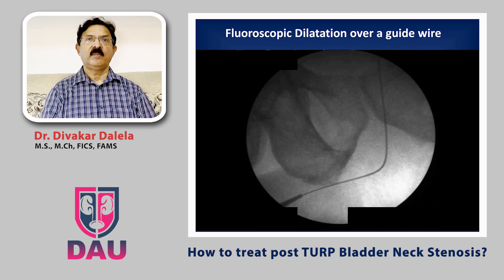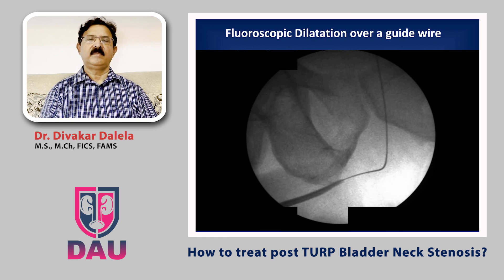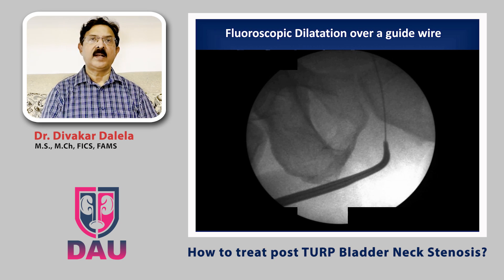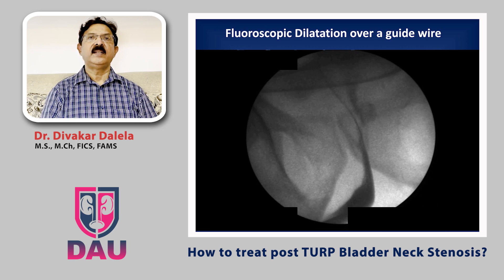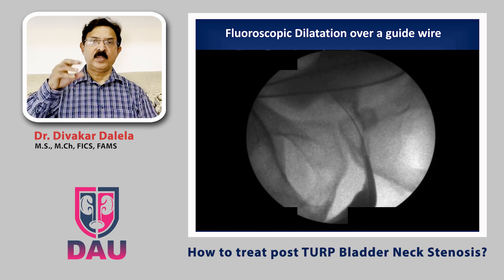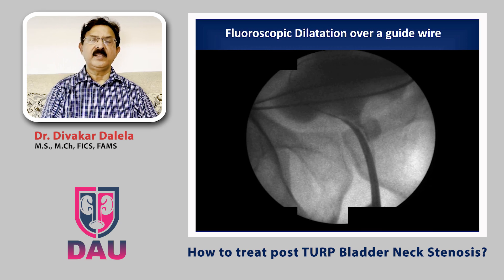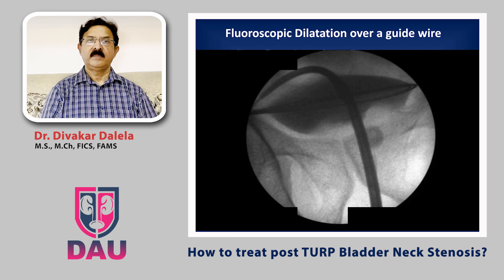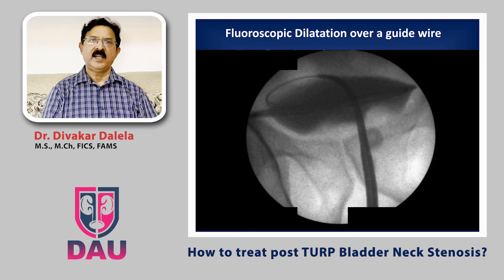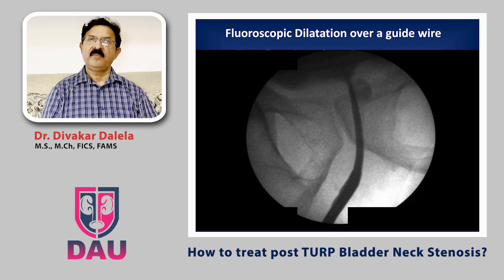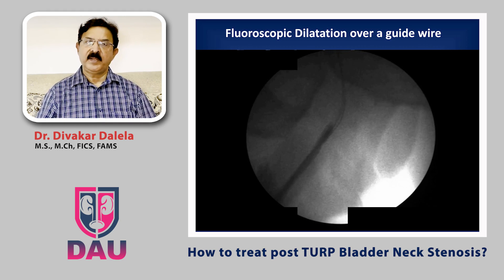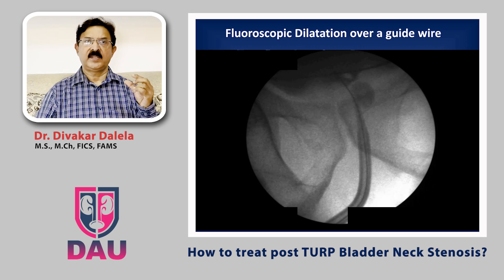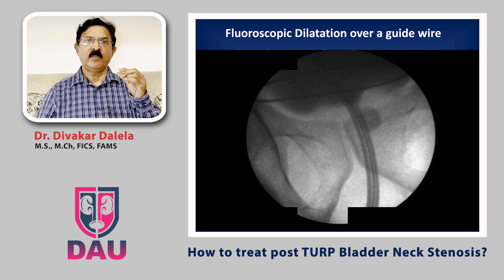Let me show you a fluoroscopic video of a patient who had a very fine, thin septum-like bladder neck stenosis. In this patient we have put a guidewire through the urethra into the bladder neck and into the bladder, and then contrast is being injected. You will appreciate that narrow area of stenosis in the bladder neck — just below that, the contrast shows dilated prostatic urethra — and over the wire you advance a single-stage dilator. You can use any fascial dilator to do this job. The entire process is done under fluoroscopic control under local anesthesia. After that the patient will void normally; you can dilate to a greater degree using wider dilators of 20 French or 22 French to make the caliber of the bladder neck even bigger.